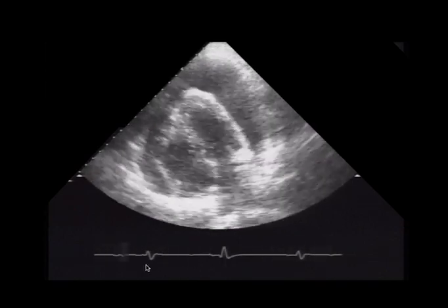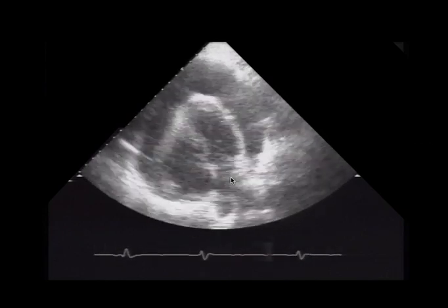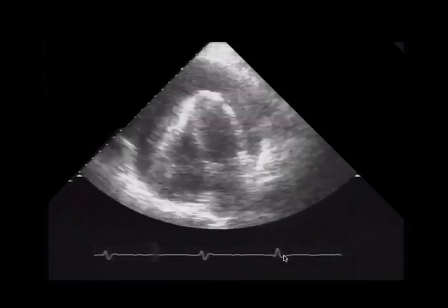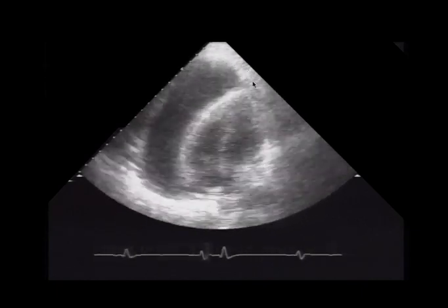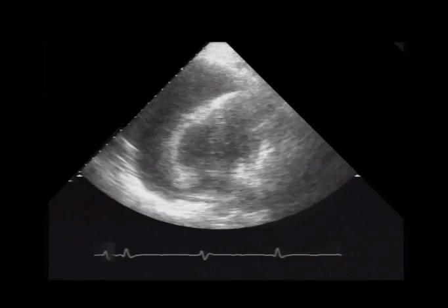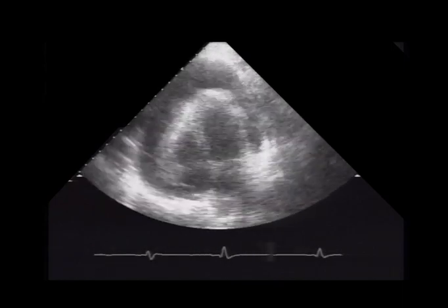the axis of the heart changes from this way to this way, beat to beat. The axis of the heart changes. And that happens when you've got the heart swinging around in a very large pericardial effusion. But the most common finding on an electrocardiogram of pericardial tamponade is not electrical alternance. It's just simply low voltage ECG. But it is cool when you see electrical alternance. But again, echo is a much better test than electrocardiography is for this diagnosis.